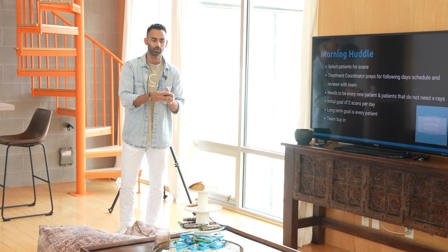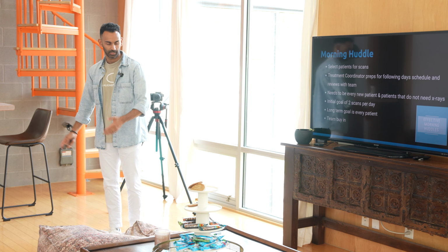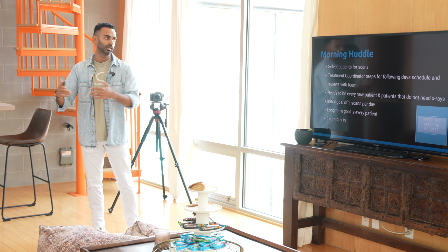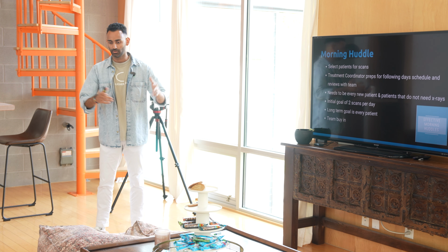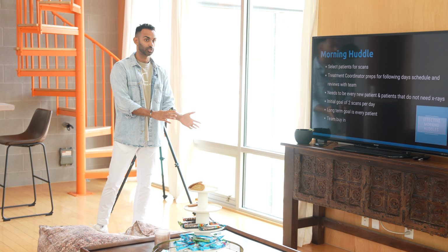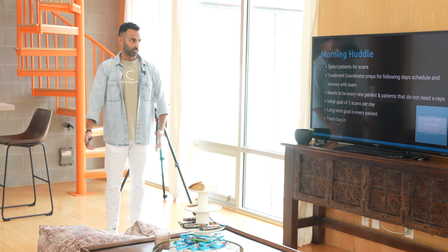In the beginning, if you're only scanning 2 patients, you might as well scan the ones who can be qualified for a treatment that is going to be worth everybody's time. Because as we'll get into later about incentives, bonuses, stuff like that, everybody is going to be more in that thought pattern. Again, if you don't even want to do that, you could pick any 2, but that is just some structure that we found was helpful to really make the most of the initiative of getting scans into the practice. And again, the long-term goal is it's for every patient, right? But you've got to start somewhere.